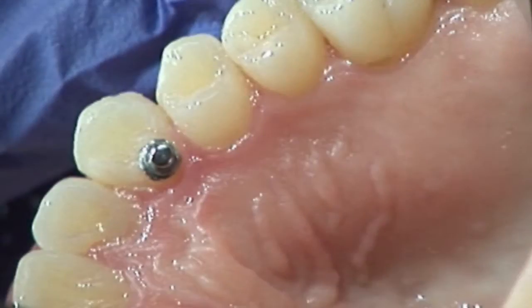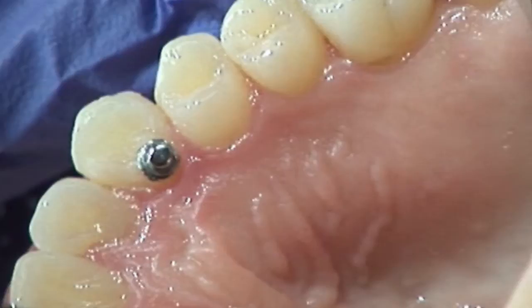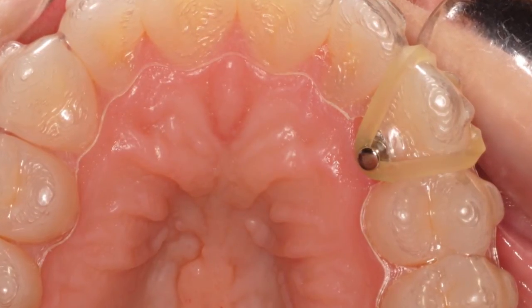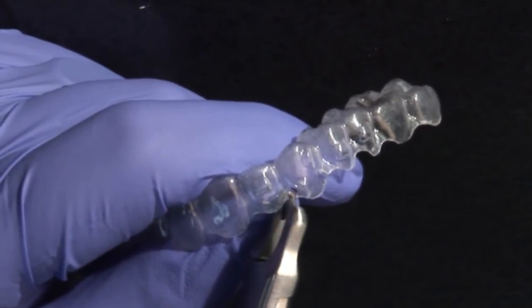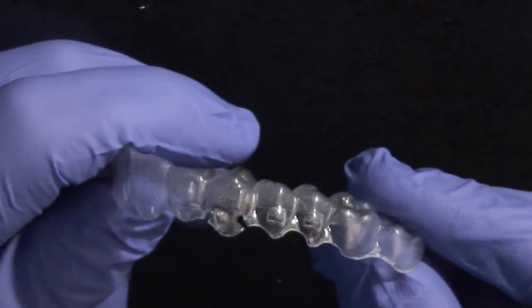In this instance, a bonded button is placed on either the buccal or lingual surface of a tooth, near the gingival margin. The hole punch is used to provide relief of the aligner around that button. The teardrop is then used to create elastic hooks at the gingival embrasure spaces on both the mesial and distal of the problematic tooth.